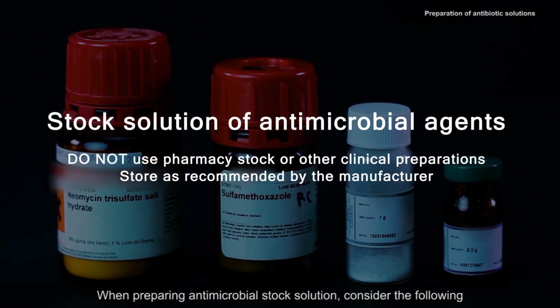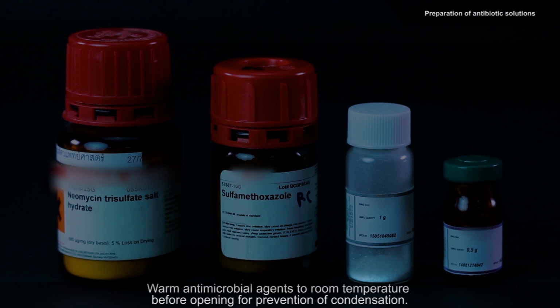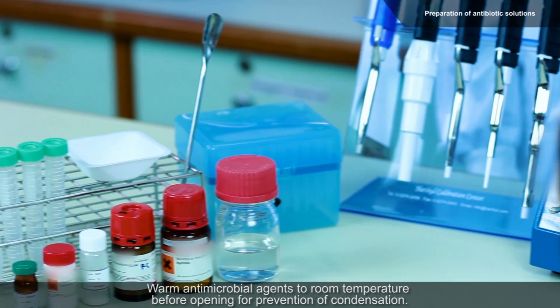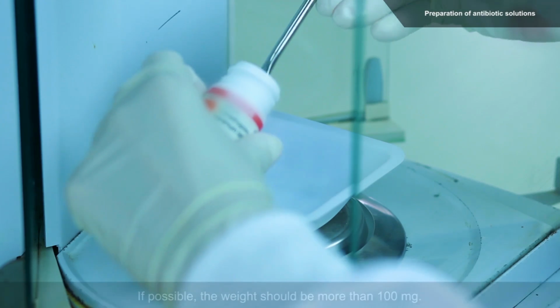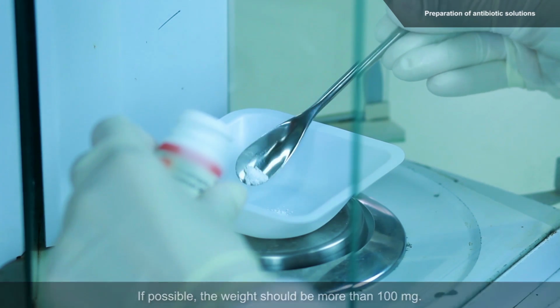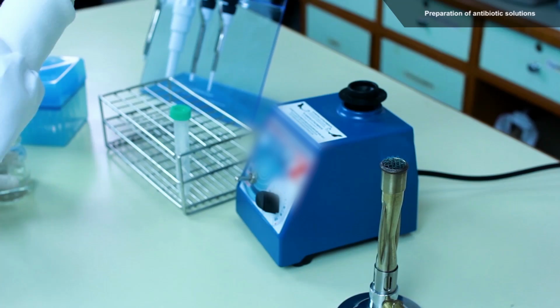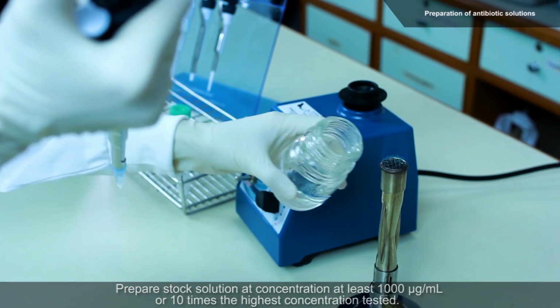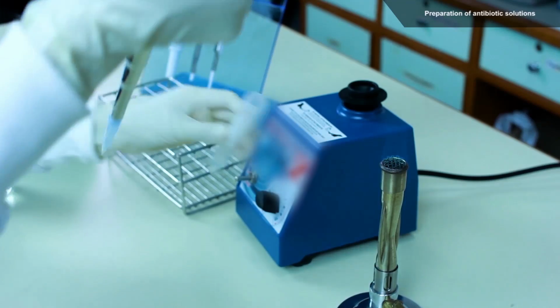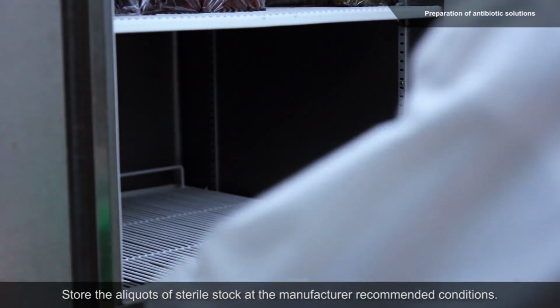When preparing antimicrobial stock solution, consider the following. Do not use pharmacy stock or other clinical preparation, and store it as recommended by the manufacturers. Warm antimicrobial agents to room temperature before opening for prevention of condensation. If possible, the weight should be more than 100 milligrams. Prepare stock solution at a concentration of at least 1,000 micrograms per milliliter or 10 times the highest concentration tested, and store the aliquots of sterile stock at the manufacturer recommended conditions.